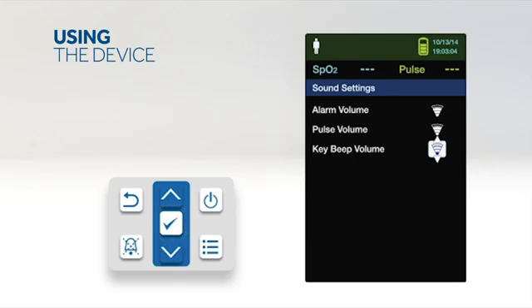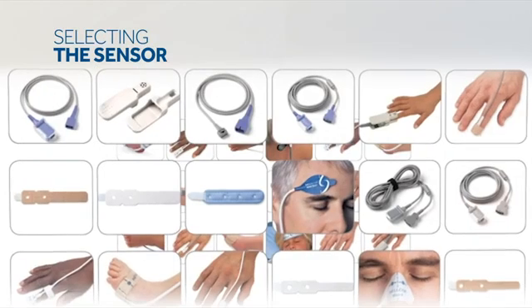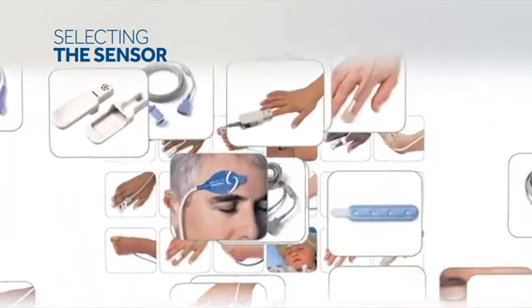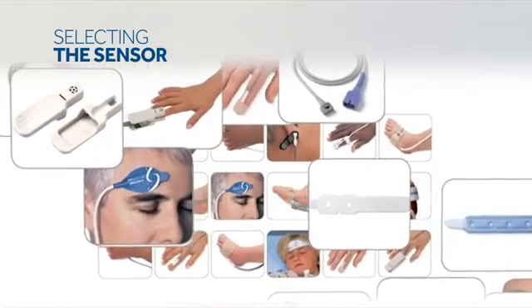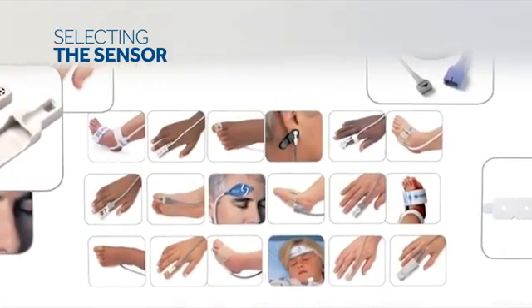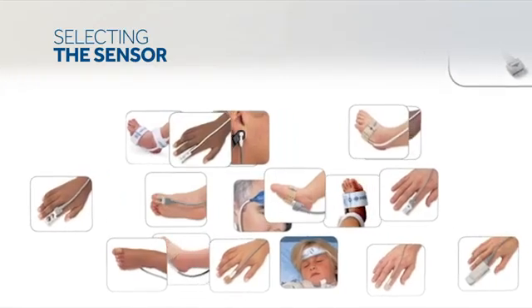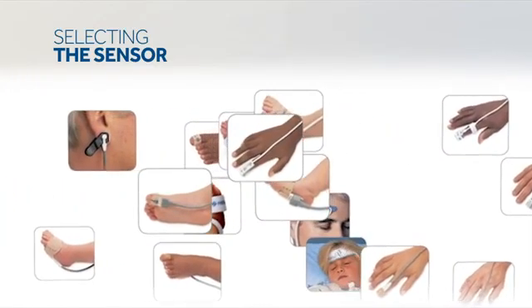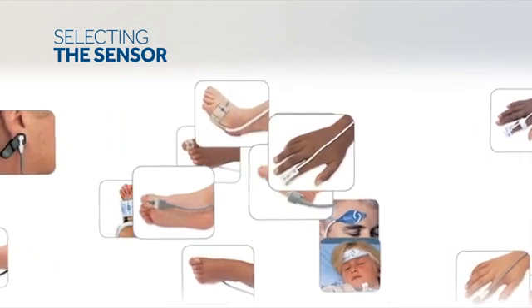Press the OK button to save the desired volume level. Select a compatible Nellcor pulse oximetry sensor for the patient and desired application. When selecting a sensor, consider the patient's weight and activity level, adequacy of perfusion, availability of sensor sites, need for sterility, and anticipated duration of monitoring.